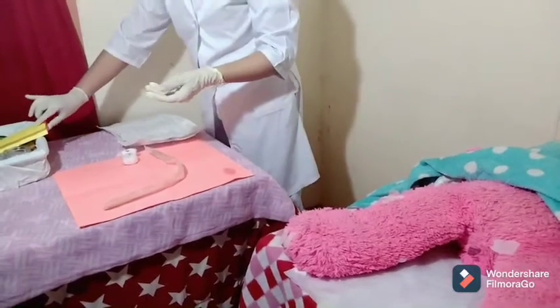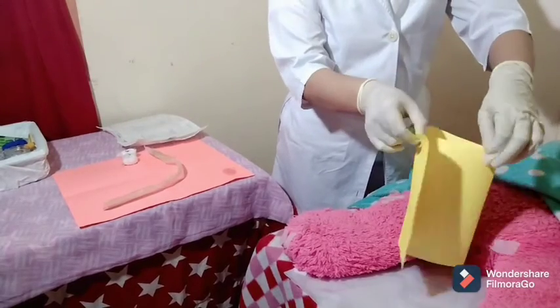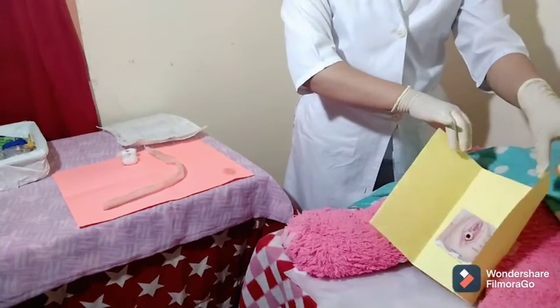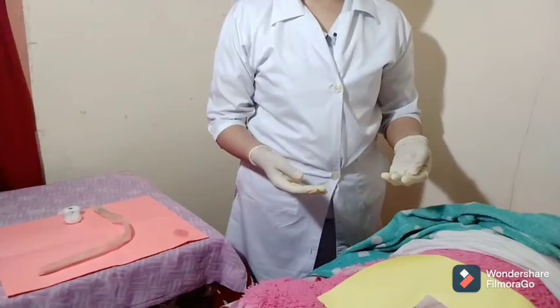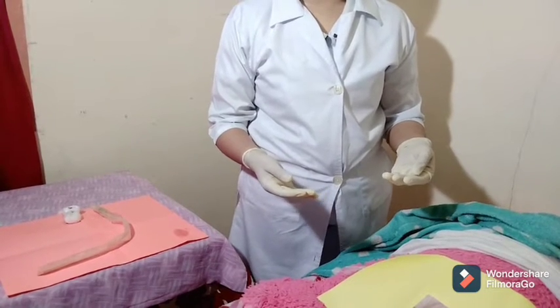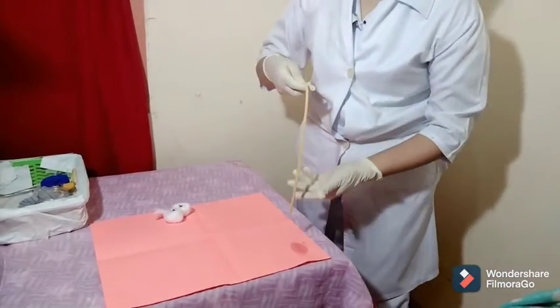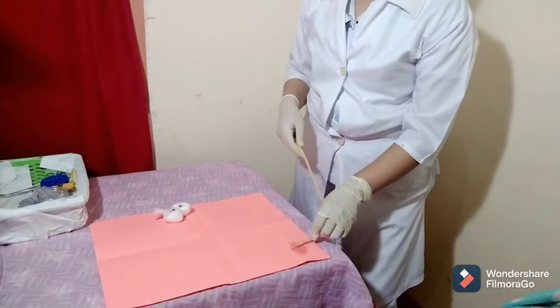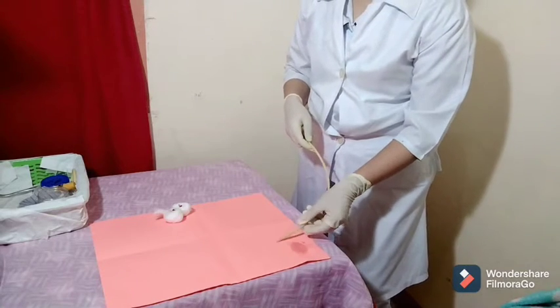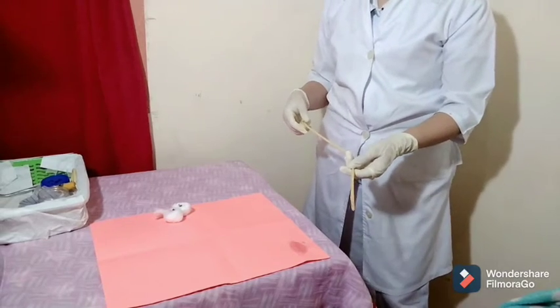Grasp the upper corners of the fenestrated drape and unfold it without touching the sterile areas. A drape provides a sterile field where the equipment and hands will be placed, and prevents accidental contamination from adjacent areas. Lubricate 2 inches of the catheter tip, avoiding clogging the tip of the lumen. Lubrication facilitates the insertion of the catheter and reduces trauma to the tissues.